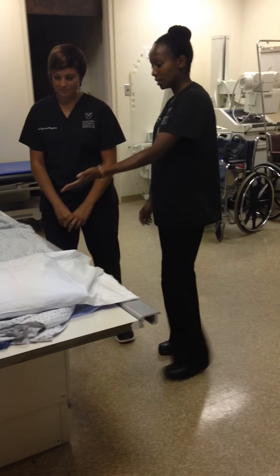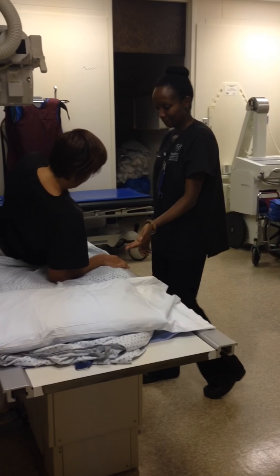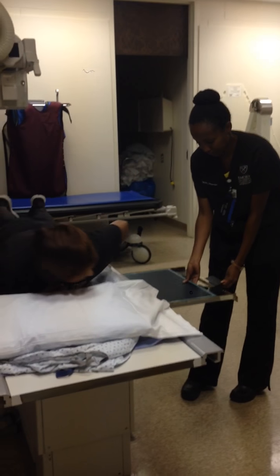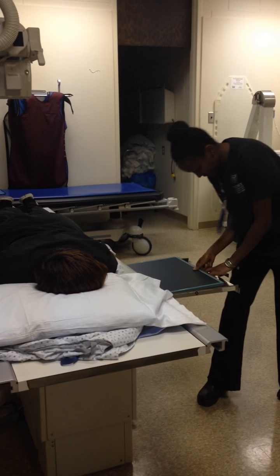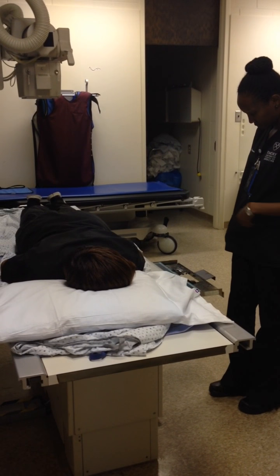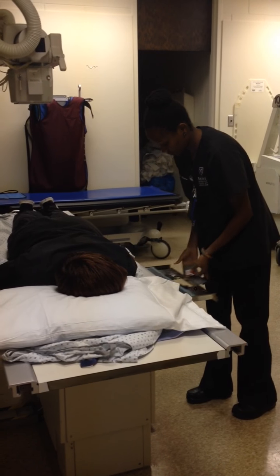The technologist starts the exam by getting a 14 by 17 cassette and placing it lengthwise in the table bucky. It is important to make sure to put the bucky at the head of the table so the technologist has room to work with. Place the patient in a prone position on the table with the pillow at a diagonal to the shoulder on their right side.